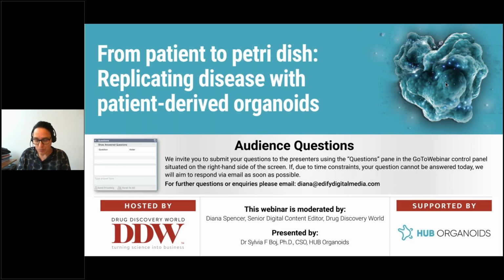With this assumption, I'll say that one of the important tricks is to try to process the sample to establish organoids as soon as possible. Because the amount of cellular material, tumor cells available in this biopsy to establish the organoids is limited, and the viability of these cells can be impacted by the time waiting to process the tissue. We have seen a significant increase in efficiency if the biopsy is processed immediately for model establishment.